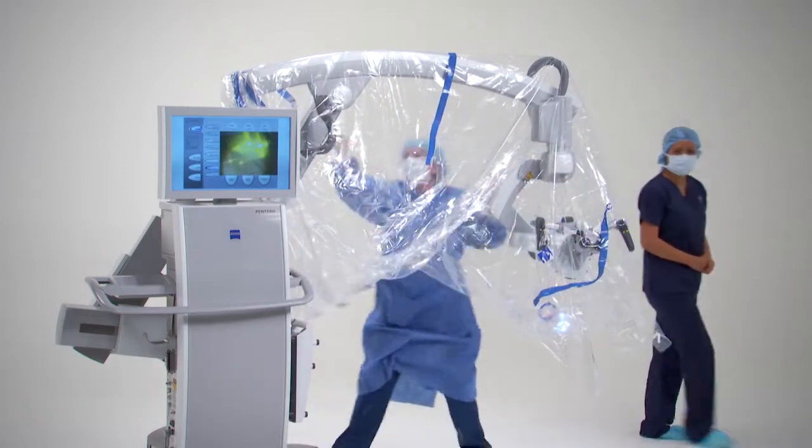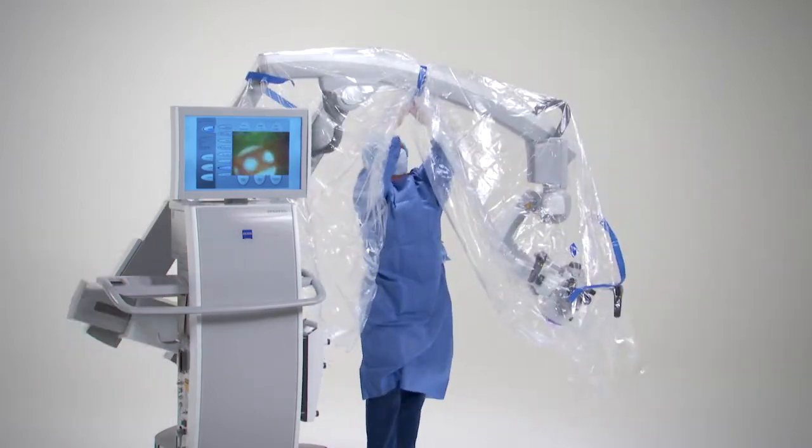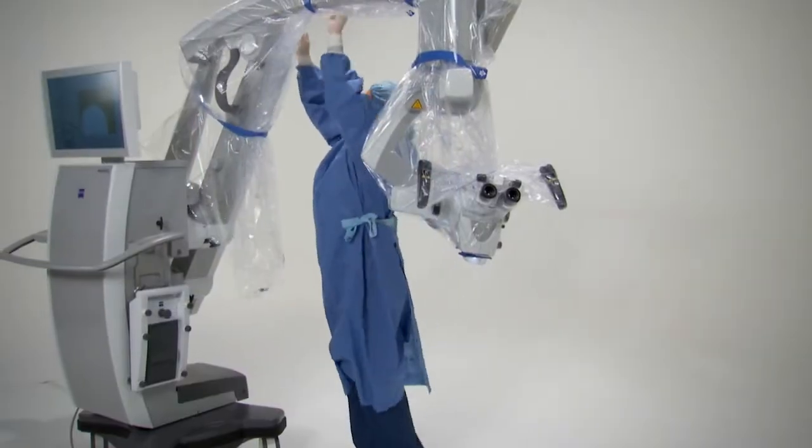Pull the drape over the rest of the arm. Using one of the straps, make the drape airtight at the farthest position.